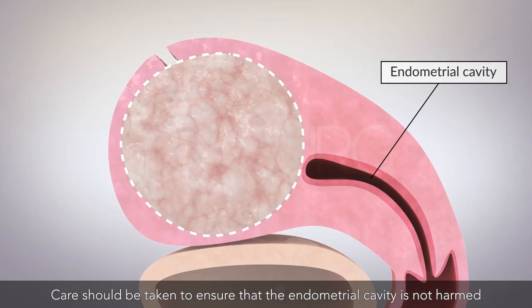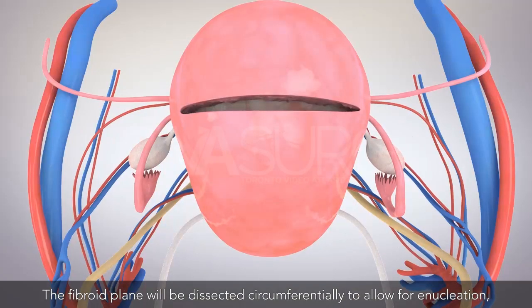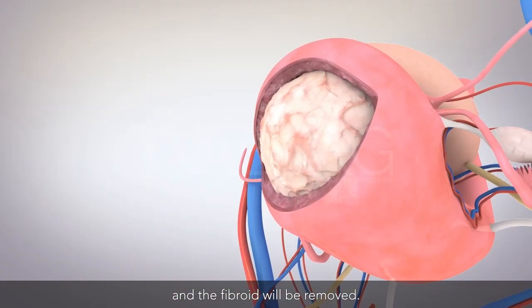Care should be taken to ensure that the endometrial cavity is not harmed during the enucleation process. The fibroid plane will be dissected circumferentially to allow for enucleation, and the fibroid will be removed.